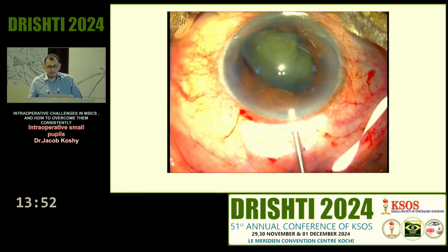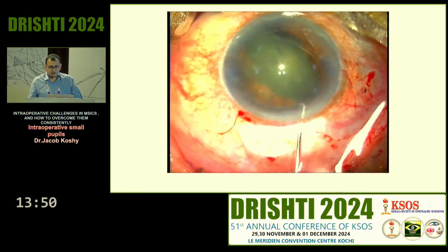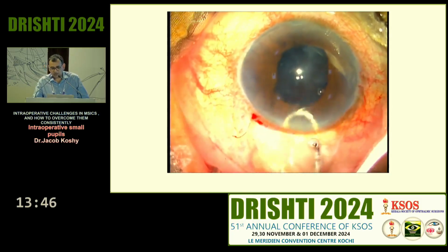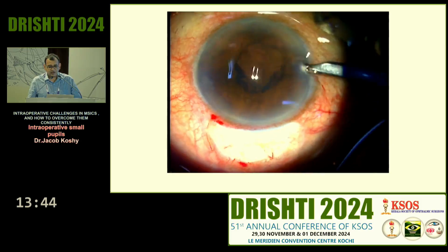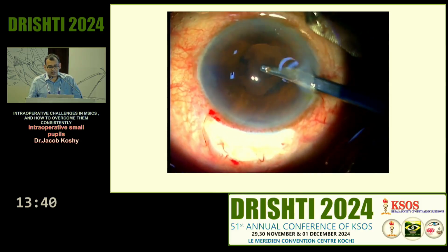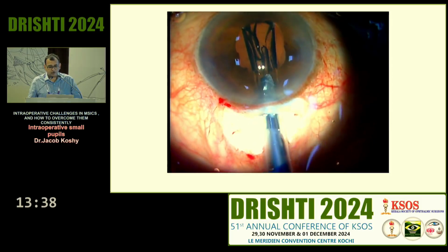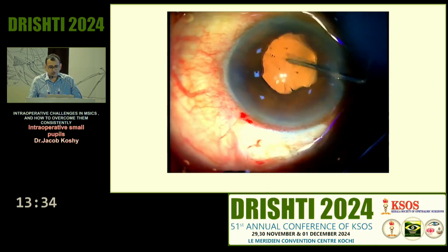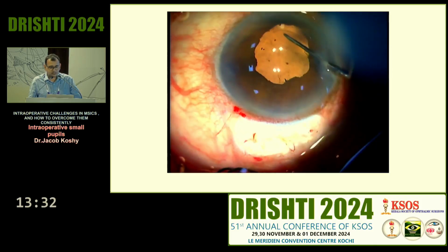When you're prolapsing the nucleus, sometimes because of the stretch that you've created, the iris keeps coming in. Be careful when you're removing the nucleus. And again, during IA, you can easily catch the iris, you can catch capsules, so you need to be careful of what you're doing. Any lens can be put in if everything is going smoothly, whether you want to put in a PMMA or a foldable lens, and that should be fine.